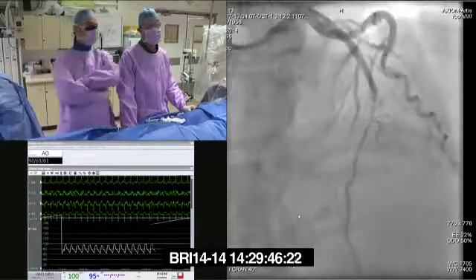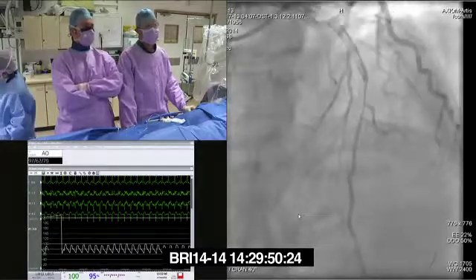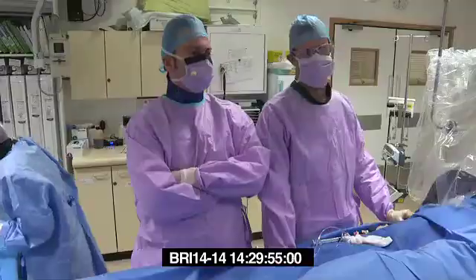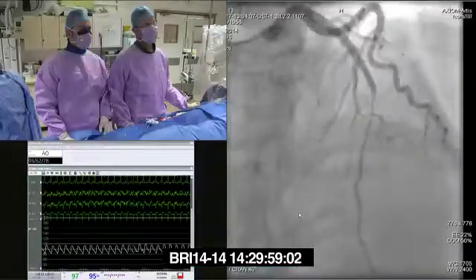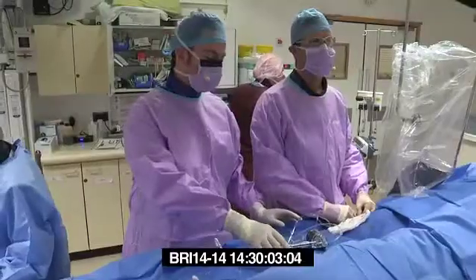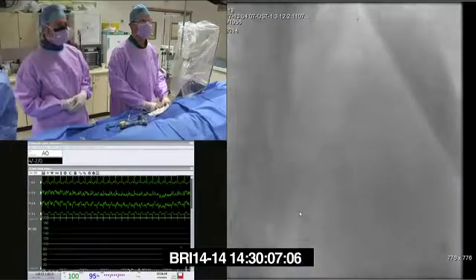Okay, I'm going to direct stent this. I don't think there's a huge amount of disease. Proximal, we're probably a 3. Distal, it may taper down, so I'm going to take a 2.75 by 28, please. Make it a 23, I changed my mind. Just show me the distal wire there. That's great, okay, and back up.